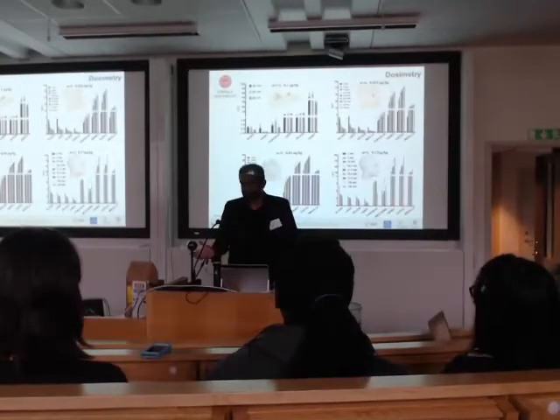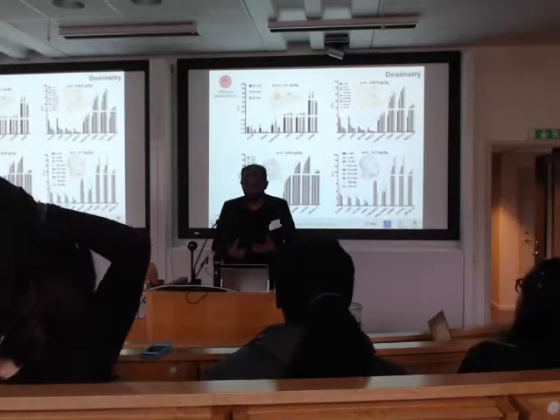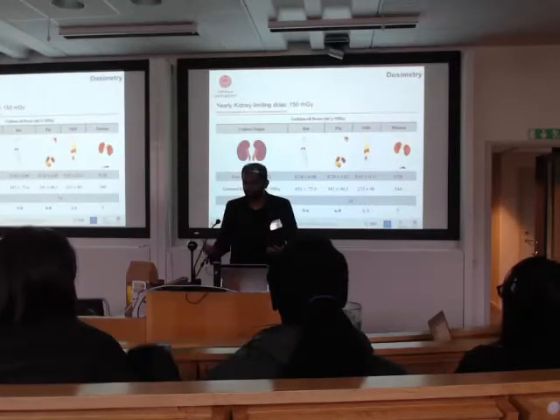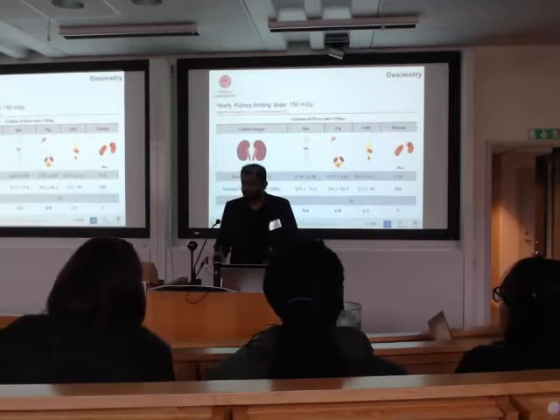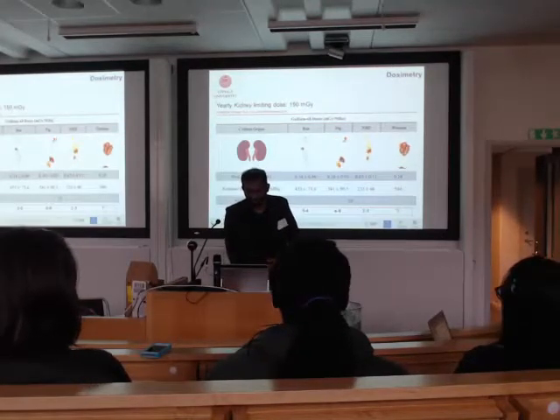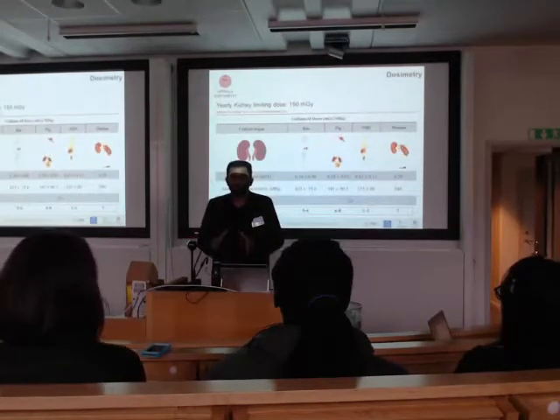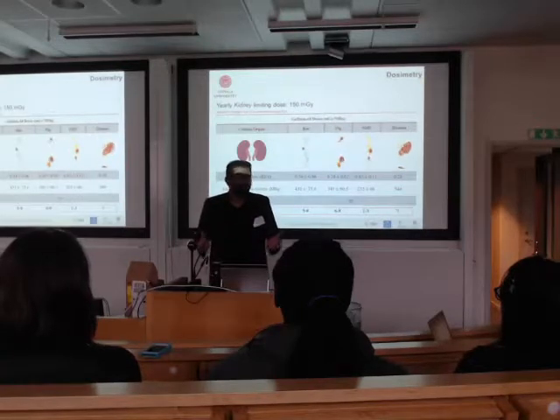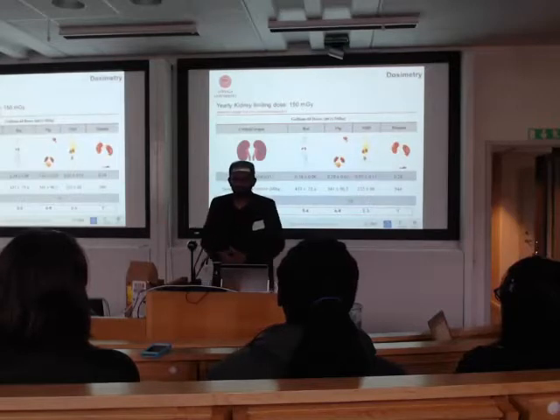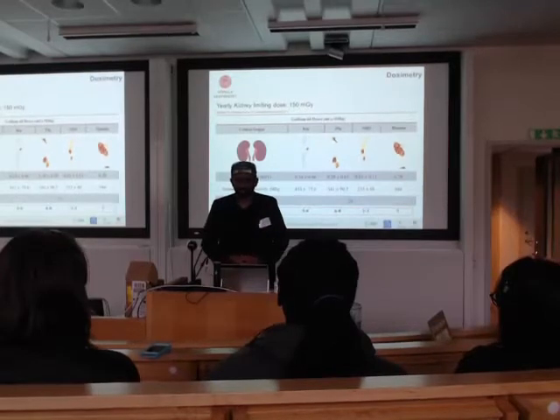As you know, this is radiation. If you want to take these things to the clinic, you have to perform something called dosimetry to find out how many scans can be done in a year. In this case, the kidney was the dose-limiting factor, so we estimated from the patient scan that you could do at least 7 scans per year. As far as I know, per year any patient just goes through 2, maybe 3 to 4 scans. So this gets an OK pass, so that you can do that in clinical studies. So this is pretty much what we do at our platform.